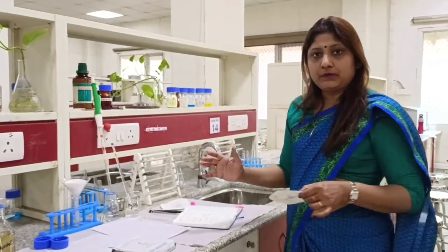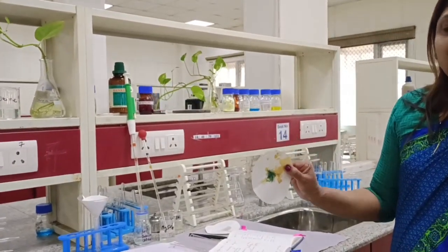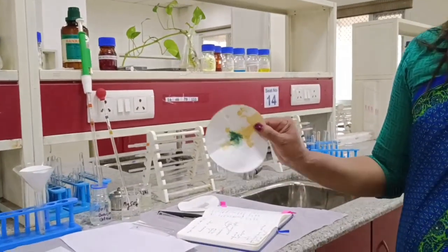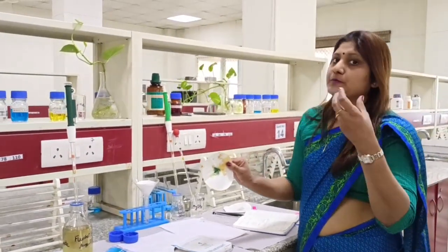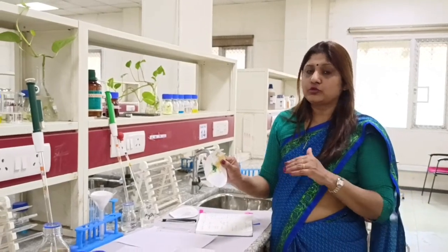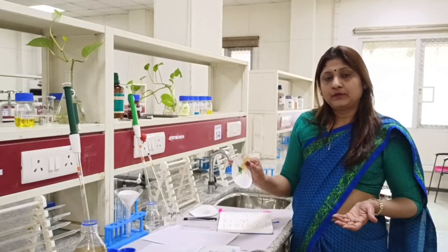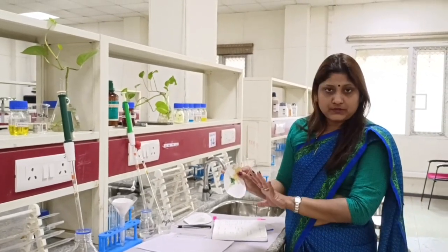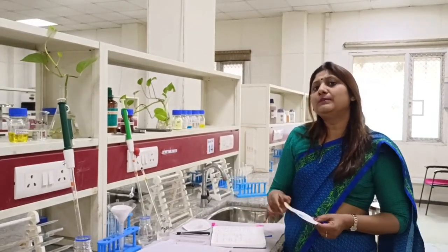A positive Fouchet's test tells you that conjugated bilirubin is present in the urine. This occurs in hepatic jaundice, where there is obstruction of the bile canaliculi, or in obstructive (post-hepatic) jaundice. In pre-hepatic jaundice, you do not have conjugated bilirubin in the plasma, so you do not get bilirubin in the urine. A positive test therefore indicates either obstructive jaundice or cases of hepatic jaundice where hepatic cells are causing regurgitation of conjugated bilirubin into the plasma.